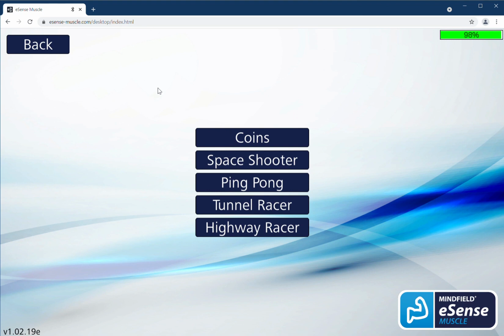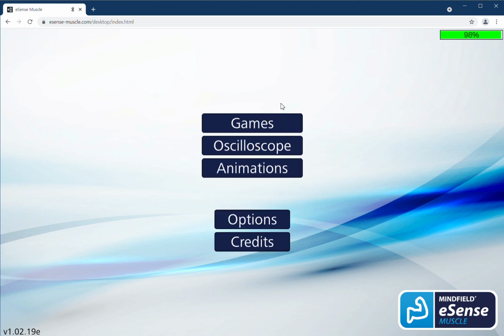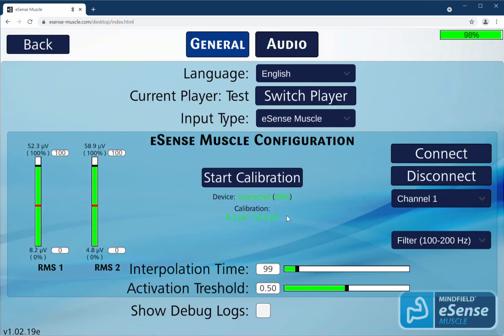So yeah, enjoy playing these games with your muscle activity or using the oscilloscope and animations. Let's have a final look here at the options where you can switch language. English, German we have at the moment. Where you can change the player name, where your high scores are saved. And here you can recalibrate, change the channel and filter here. And you can change the activation threshold. This is the one from the baseball game, where you need to fulfill that threshold to trigger a hit with the baseball. You can change some audio volume, and that's it for the moment.